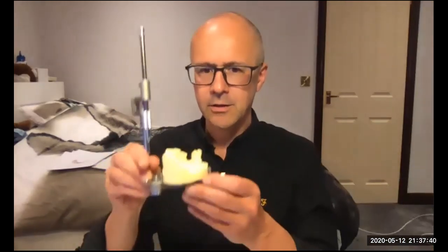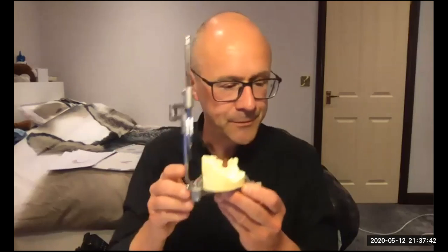Joseph Sturmer, how do you deal with bulgy little bulks of bone on the buccal side, in cases of complete dentures? So I suppose I've just got to avoid it actually, but also the other thing, Joe, this is really important: we use surveyors a lot. So the path of insertion for uppers is really crucial.